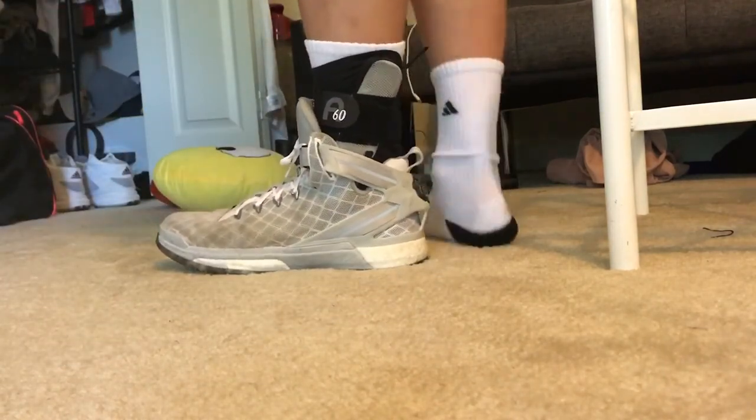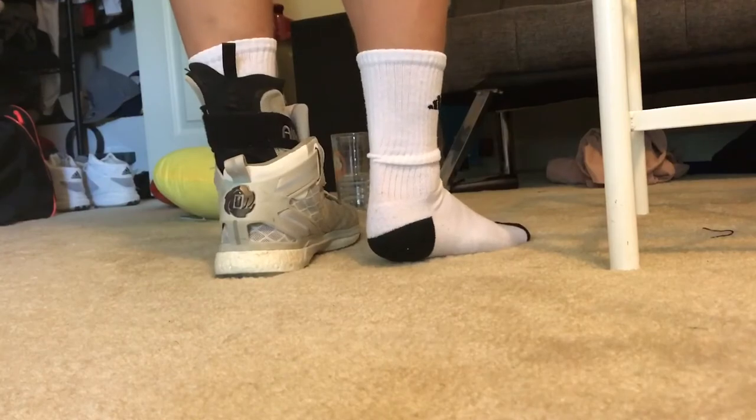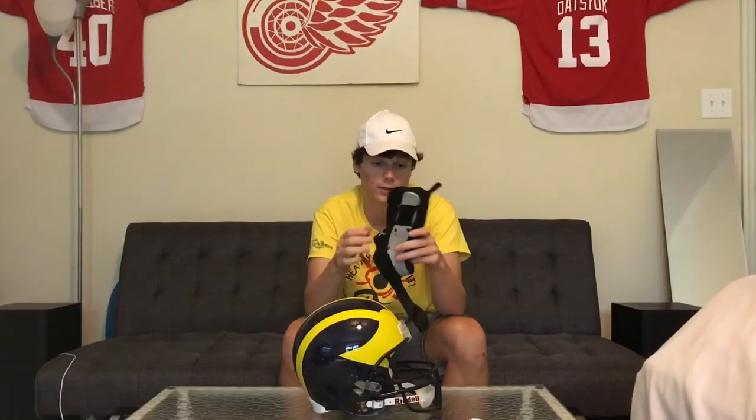I went to a doctor's appointment for a general checkup and I told him I'd been straining my ankle a lot and asked if there was anything he'd recommend. He said the Aircast — he said he played basketball and that he used this when he plays. I was like, okay, I'll try it out, and I mean, damn, has it been worth it.